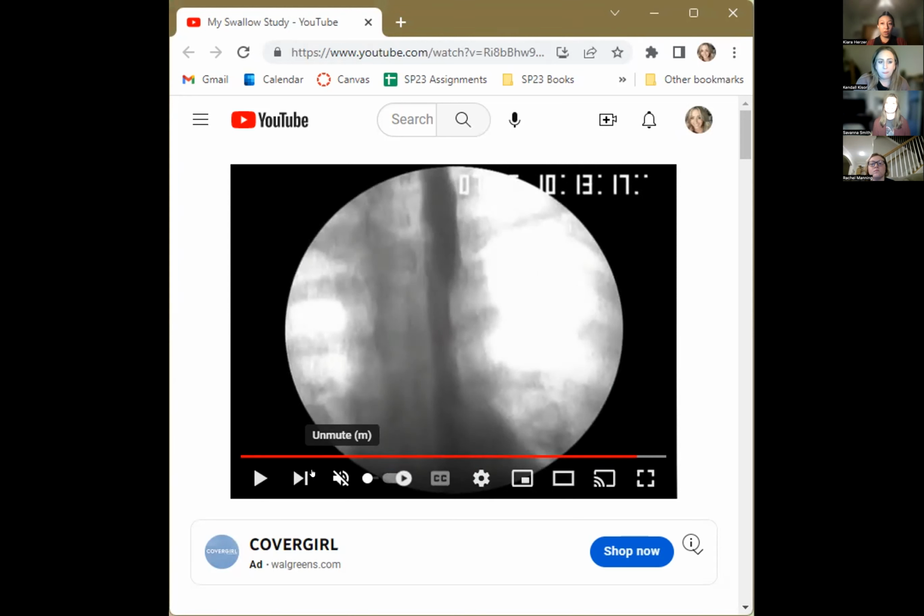Yeah, good. So what can we do? What can we do for Rachel? Yeah, so we can discuss a little further some compensatory strategies and see if there's any improvement to her symptoms while we continue to take a more in-depth view of the motility of the esophagus and see if a further examination of the esophageal phase provides us with more detailed information. Okay, thank you so much. Of course.